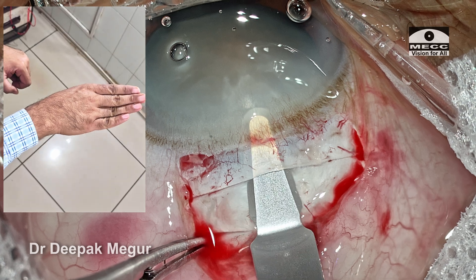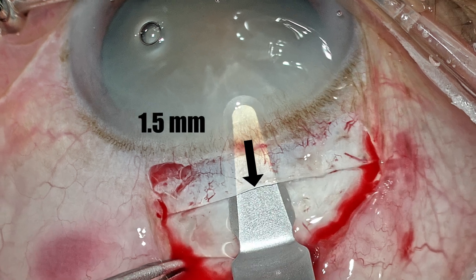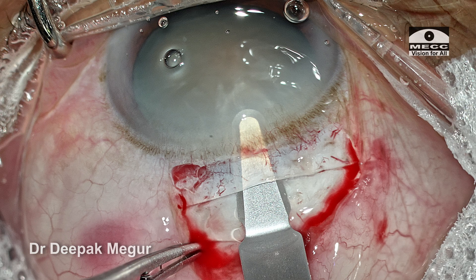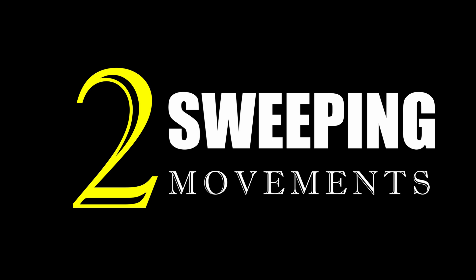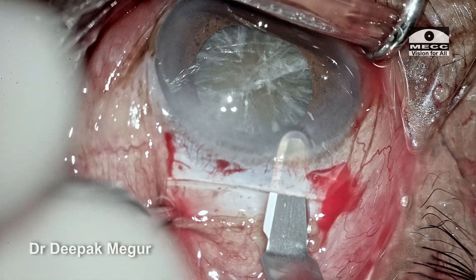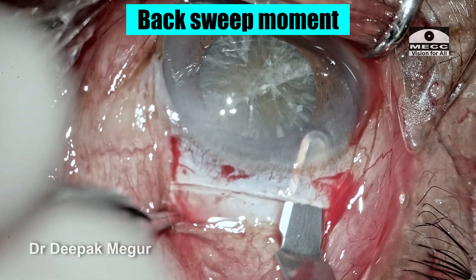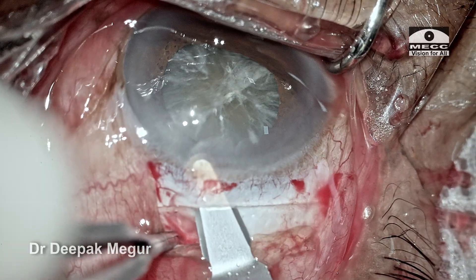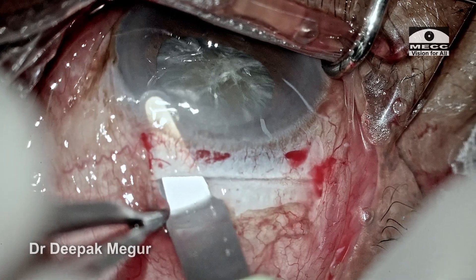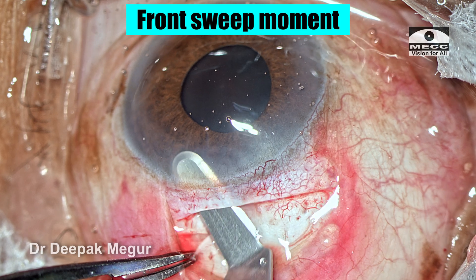The wriggling movement is continued until we reach about 1.5 mm into the cornea. Now the central portion of the sclerocorneal tunnel is done, and we have to do the lateral extension on either side. We can achieve this by doing either of two sweeping movements. In the first variant — the back sweep — the blade begins at the corneal end and moves backwards towards the sclera. The globe is firmly fixated as the back sweep movements are continued laterally, creating the scleral side pockets at the extreme ends.